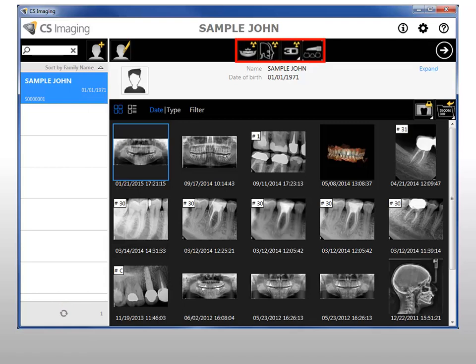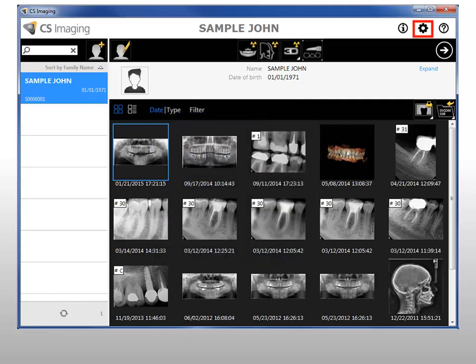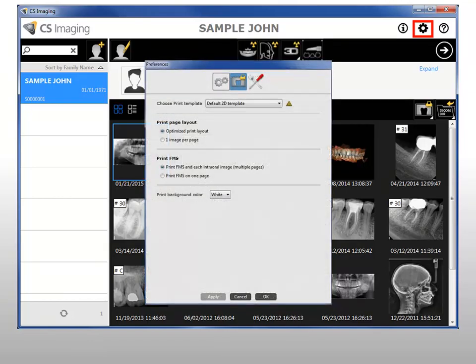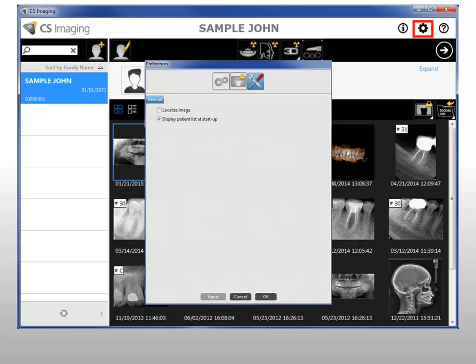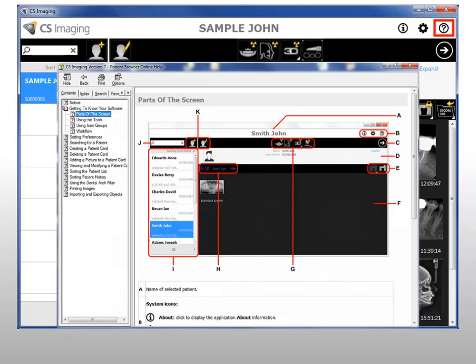Extraoral acquisition tools are used to acquire images directly to the patient history. System icons include About, which displays application information, and Preferences, which include General Preferences, Print Preferences, and Service Preferences. In Service Preferences, select here to display or hide the patient list on startup. Deselect this preference if your office would like the list hidden for patient privacy. The question mark icon launches online help.